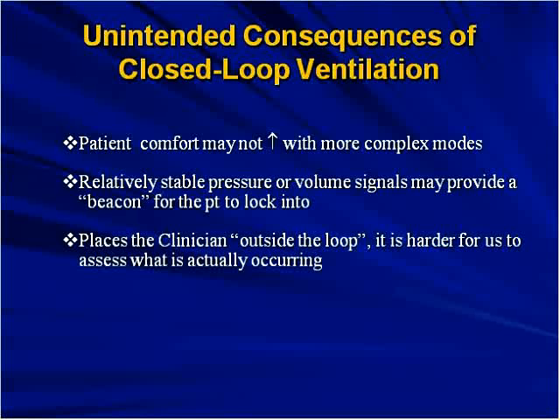Okay, so using pressure support levels of probably in the range of 10 in patients with COPD, with a high flow termination criteria of about 40% maybe, and a minimal rise time should help limit inspiratory time and tidal volume and prevent more gas trapping. And that less gas trapping should help maintain blood pressure. So it's the first thing, if someone is hypotensive with COPD or status asthmaticus, the first thing I'd be worried about is air trapping, measuring intrinsic PEEP, and trying to minimize that.